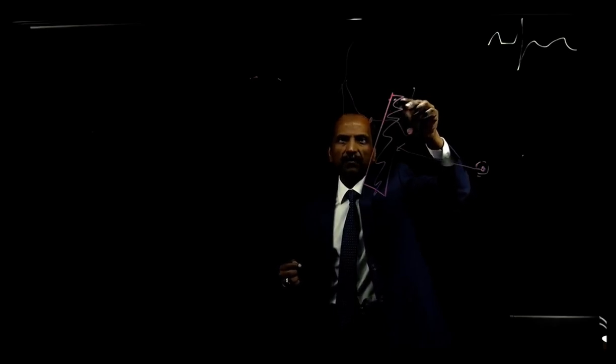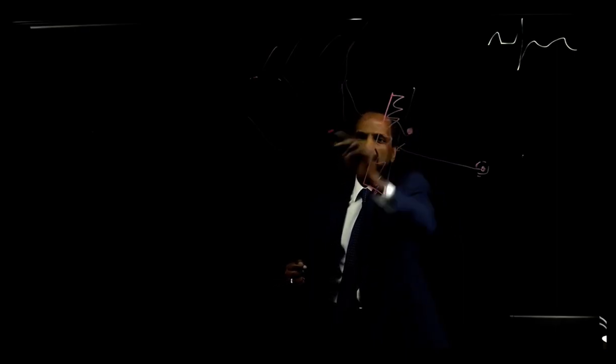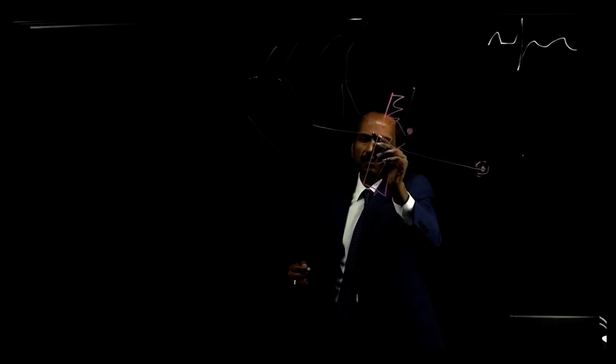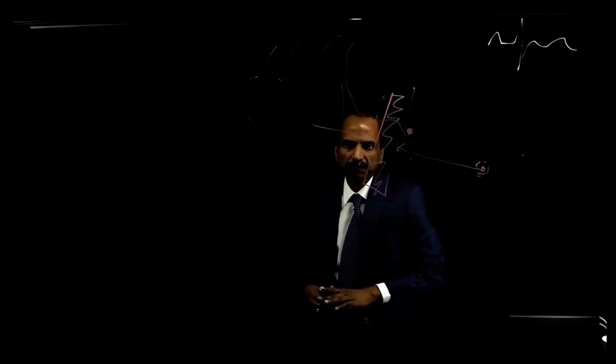I think if we wanted to, we could do a multi-electrode map, grid, pentarray, any of those, even a non-contact map on one side of the line. But then when we get close to the line, it's probably better to do point-to-point mapping, so we don't have those crossover type points.